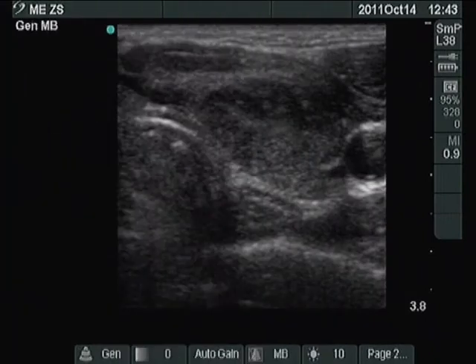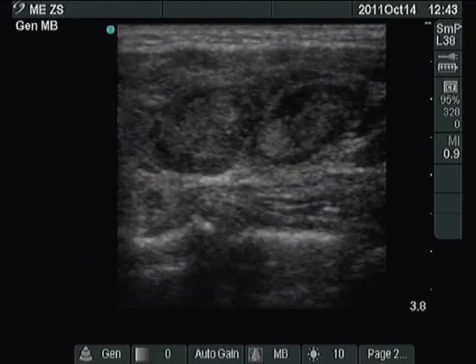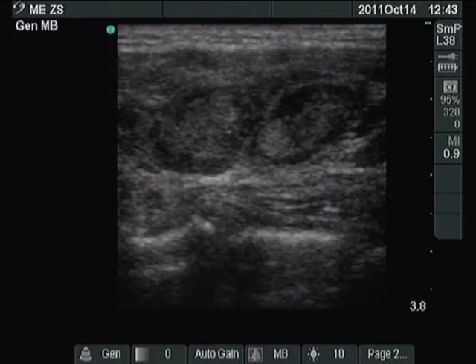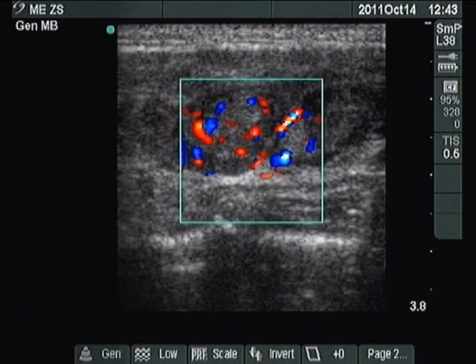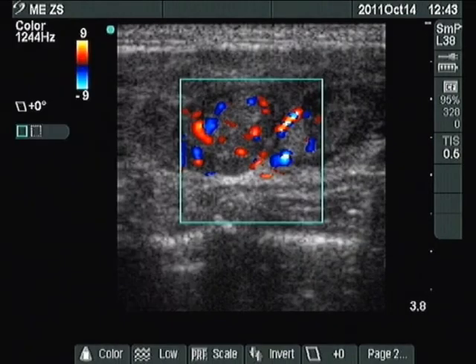There are mixed hypoechoic-hyperechoic circumscribed areas in the left lobe separated by fibrous tissue. The question is whether these lesions are nodules in a pathological sense or only secondary lobules frequently seen in lymphocytic thyroiditis.